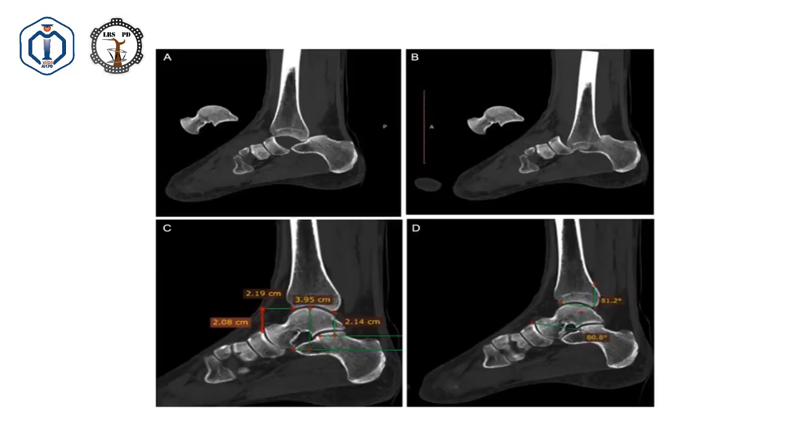Here is an example of doing the traditional tibiocalcaneal arthrodesis. This is the traditional one with the calcaneus under the tibia and the remnant of the talus or navicular matched with the anterior part of the distal tibia.